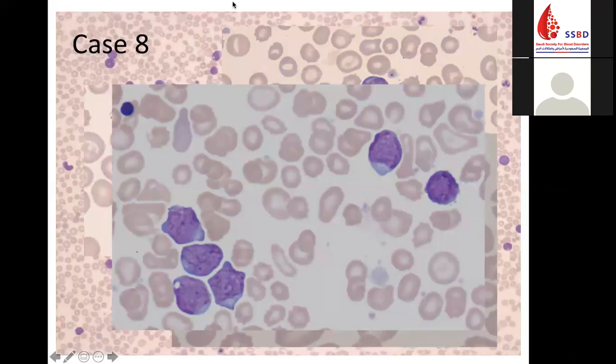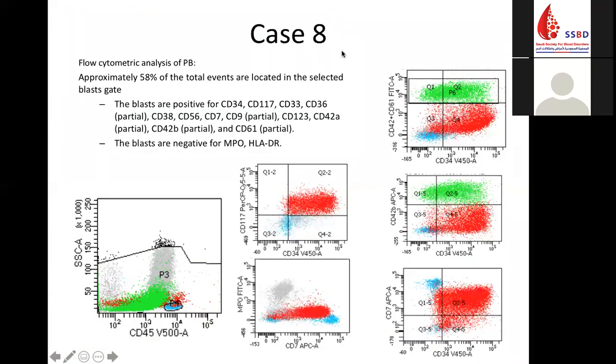So what do you think? Down syndrome, 4 days, circulating blasts, 60%, leukocytosis. So somebody here is saying that this is AML M7. Okay, what do you think? TAM, thank you. Could be a TAM.